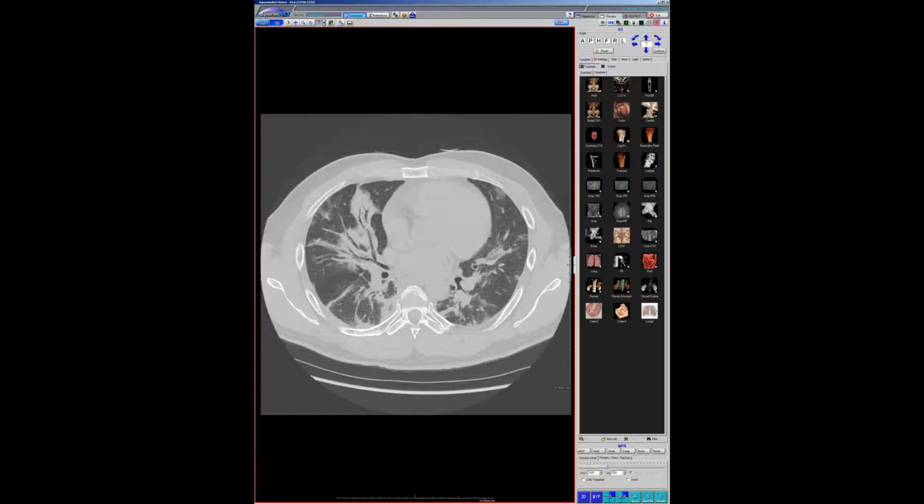So that might be some complication. Right. A person's getting worse, or has a new set of symptoms, or a person might have a pulmonary embolism. By the way, COVID predisposes to pulmonary embolism. So it seems to predispose to thrombosis and stuff like that. So if somebody is in the ICU and they're doing okay and they're suddenly worse, there could be a PE, and that might be an indication to do a CT directed at pulmonary embolism.